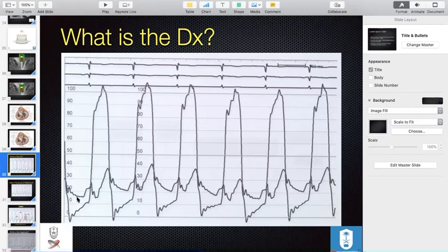Now, into pathology. So you correlated. What's happening here? In diastole, they should overlap, right? In diastole, they should be together. There should be no gradient. But here, there is. You see, there's a gradient here. Usually the gradient happens early, but here it isn't the whole phase of diastole. So there is a gradient between the left atrium and the left ventricle. So what does that tell you? There's an AV level stenosis. What's the cause of that? It's a differential, but most commonly you're going to see that in mitral stenosis. So there is a gradient in mitral stenosis.